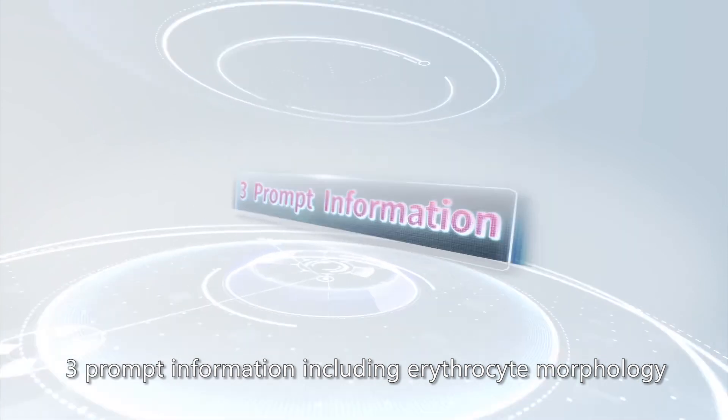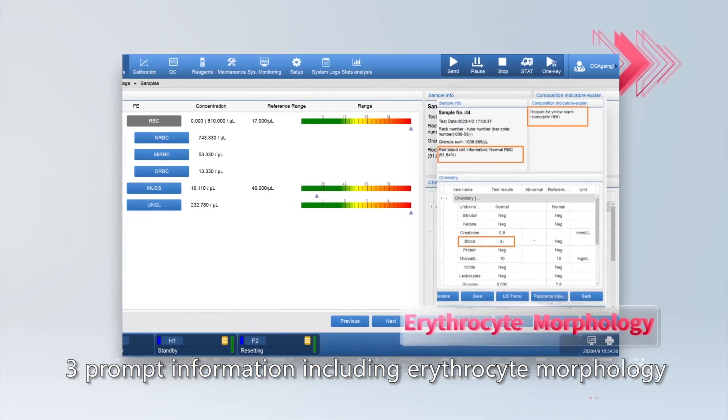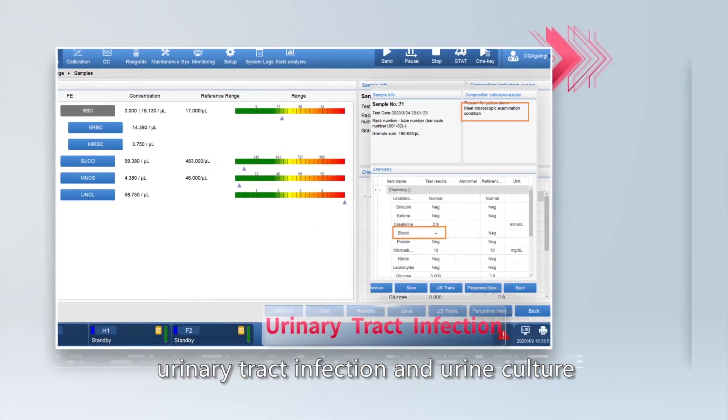3 prompt information items, including erythrocyte morphology, urinary tract infection, and urine culture.